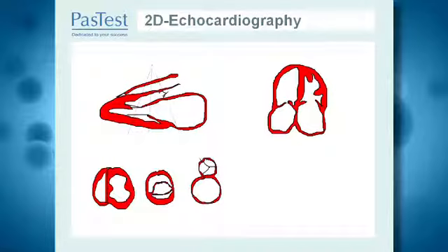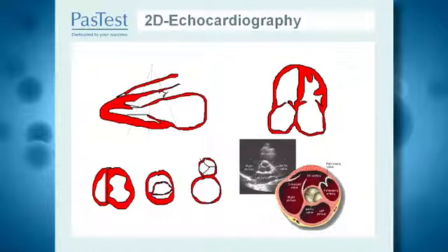On the far side of the screen here you see an apical or 4-chamber view, which gives us the classic Valentine's Day heart where you see all the chambers in what we conceptually think about as a normal arrangement. Of course, this is upside down, it's just the way the echo image is projected on the screen. By rotating the probe from the parasternal view by 90 degrees, it's possible to get the short axis cut, which you see on the far right-hand lower corner of your screen. In this view, we get a cross-section of the left ventricle, and depending on the angle, we can focus in on the aortic valve, mitral valve, or the apex of the heart.